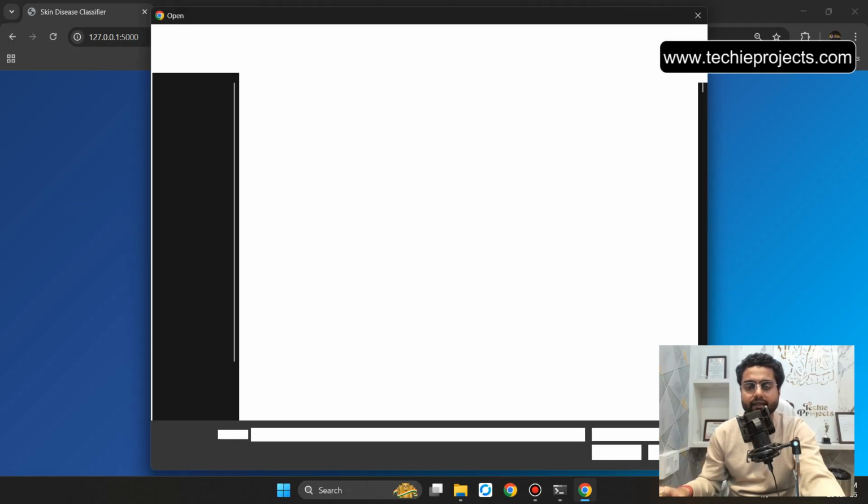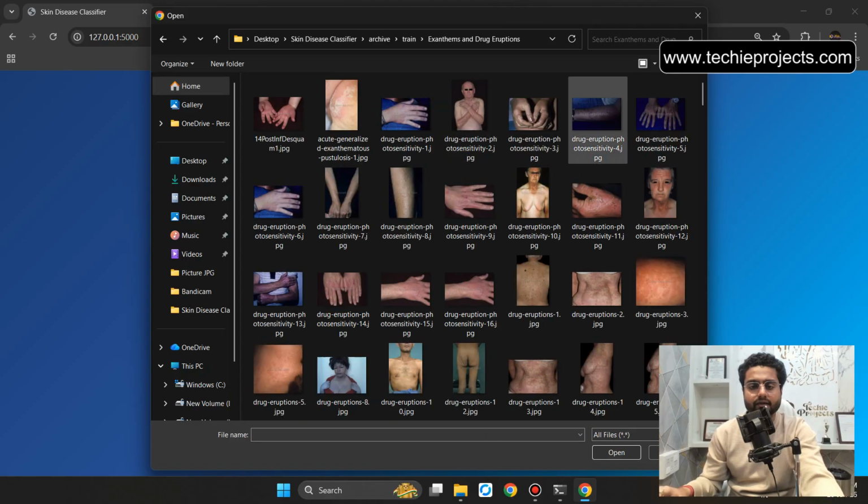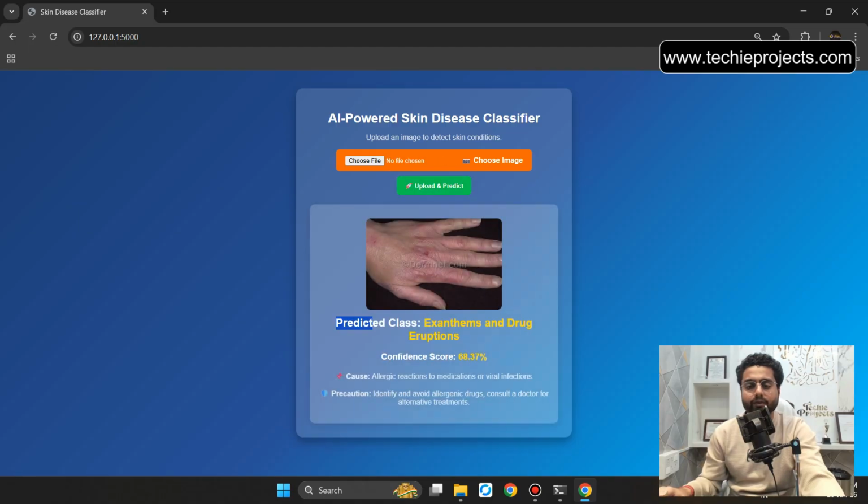So let's select any other image from a different folder, so we can check the accuracy of that particular project. Let's select this image and then click on upload and predict. So the predicted class is exanthems and drug eruptions. Confidence score 68.37% and the cause is an allergic reaction to medications or viral infections. Precaution: identify and avoid allergens and drugs, consult a doctor for alternative treatments.